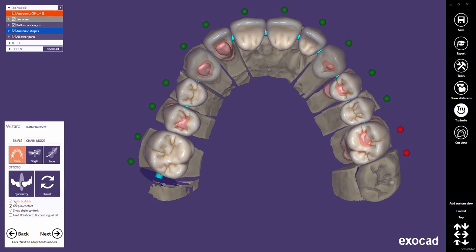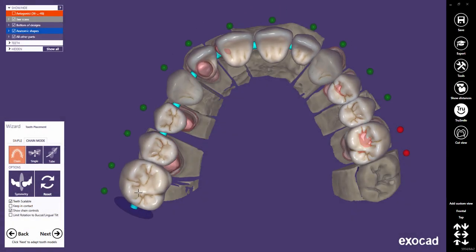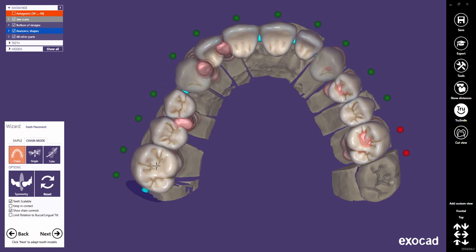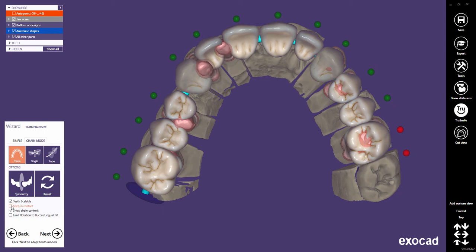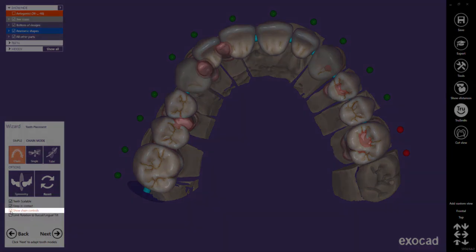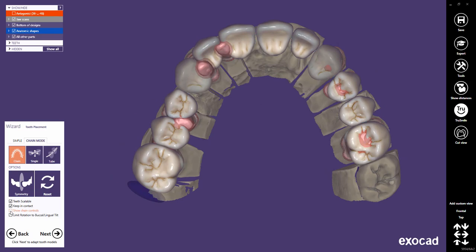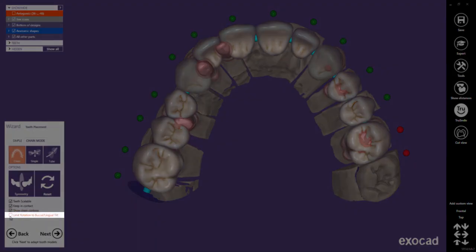By default, the teeth always stay in contact while doing transformations. If switched off, you can create gaps between the teeth when stretching the chain. Activating keep contact again will re-establish the contacts. There's another checkbox in the dialog that allows you to show or hide the chain controls.